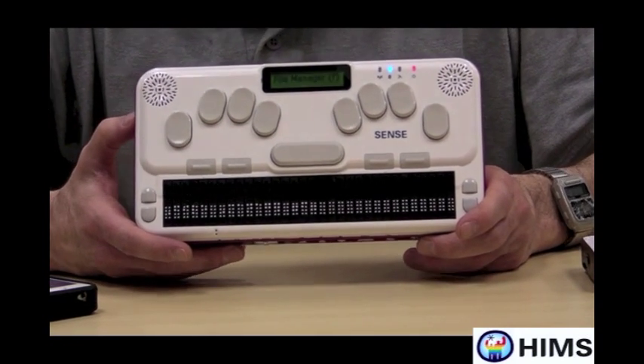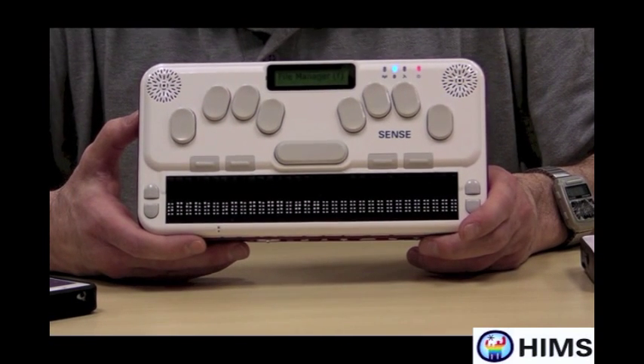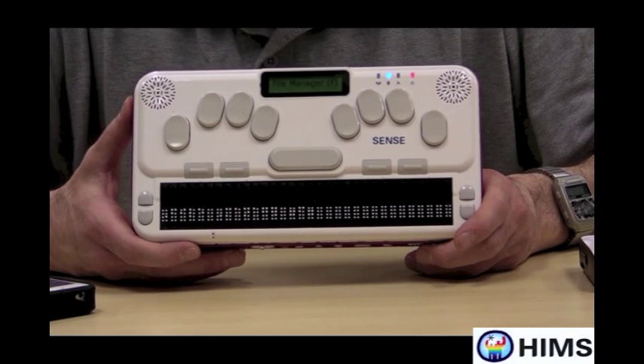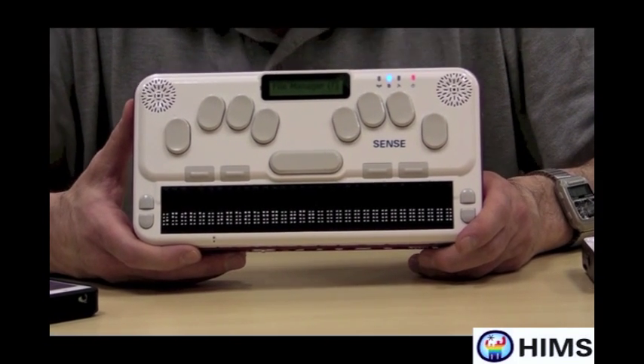The BrailleSense U2 even has built-in Bookshare capabilities, meaning that I can use the unit to go to Bookshare, find a book, download it, unpack it, all in one or two keystrokes.